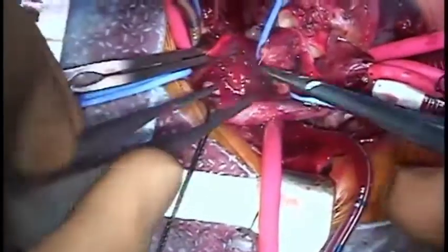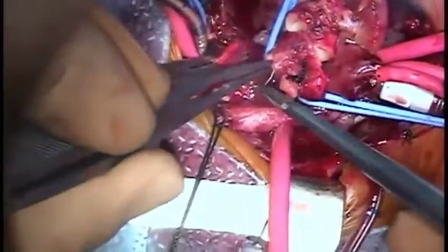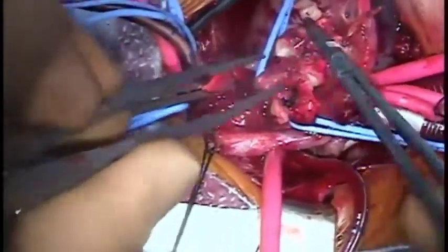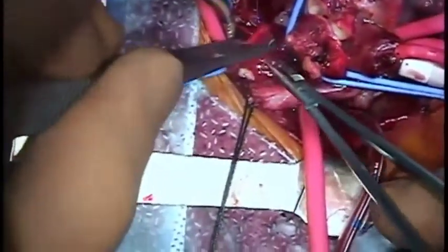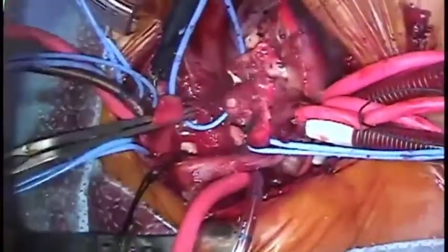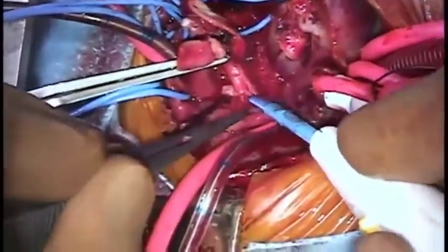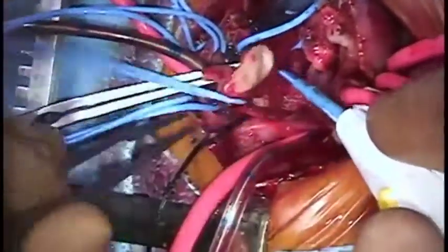The left-sided duct, which gives rise to the aberrant left subclavian artery, is also divided at this time. Having divided both ducts, the pulmonary arteries can be fully mobilised out to the first branches and a decision can be made regarding the possibility of a Lecomte manoeuvre.